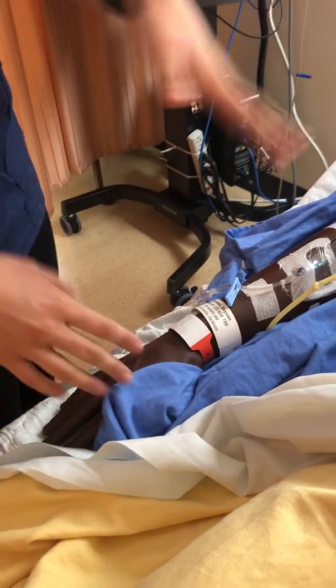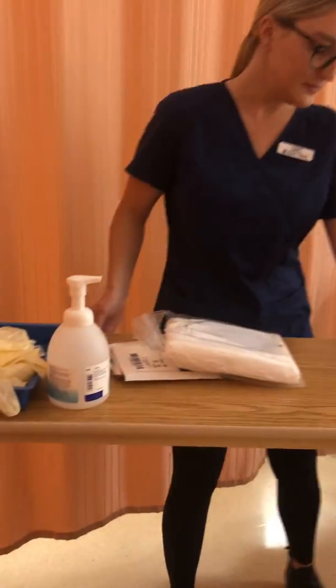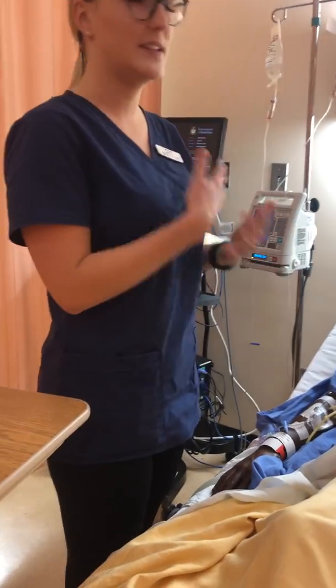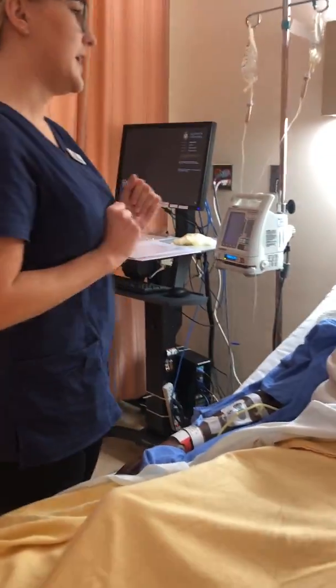Just going to confirm again. Patient hasn't changed. We haven't left the room, so correct patient. So we can start this now. I will do my initial safety check regarding the tube. So I've already checked when I entered the room that he's not in any distress. He's in the semi-Fowler's position. Side rails would be up.